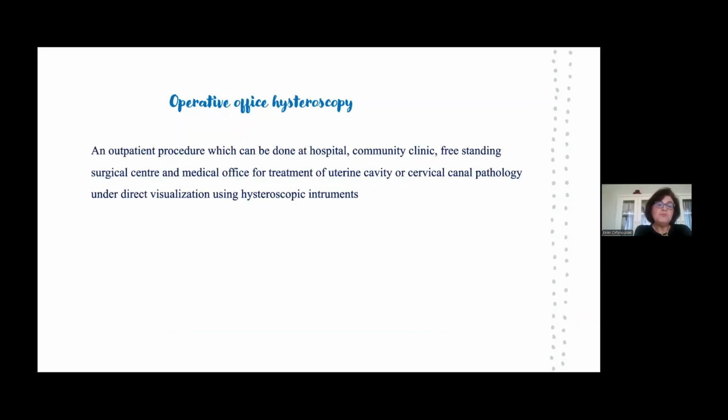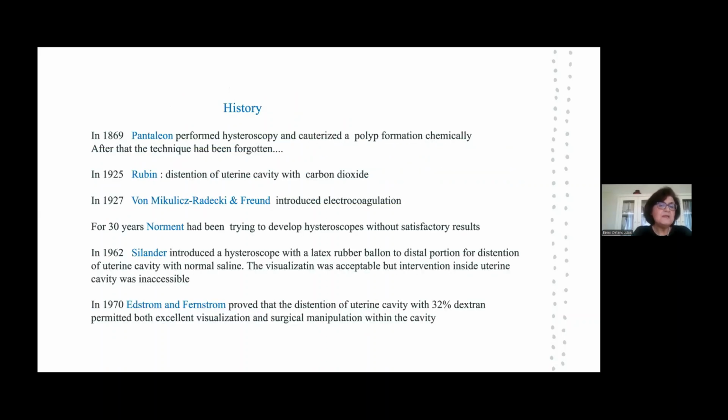Hysteroscopy is an outpatient procedure which can be done at a hospital, community clinic, freestanding surgical center, or medical office for treatment of uterine cavity or cervical canal pathology under direct visualization using hysteroscopic instruments. The history is long, but it was established in 1970.